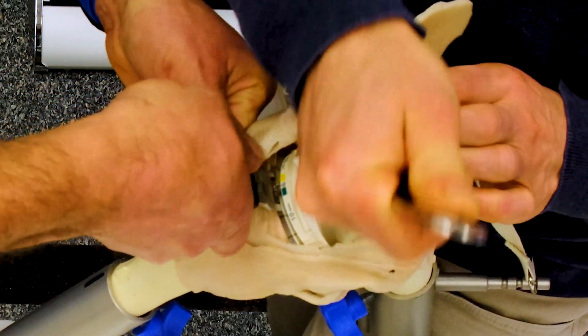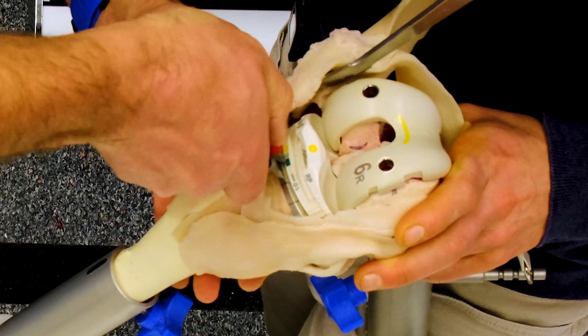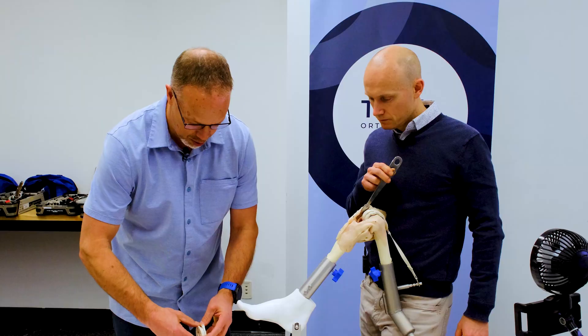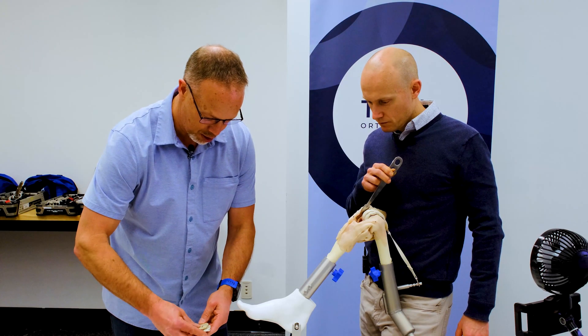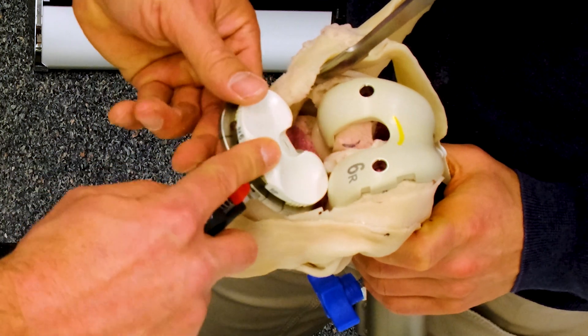I'm going to take out all of this and rebuild it on the back table with a smaller polyethylene. This is the Attune system and I can simply pop this off and pop on a smaller one. I've taken four millimeters of poly off.